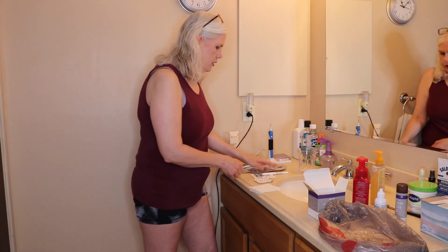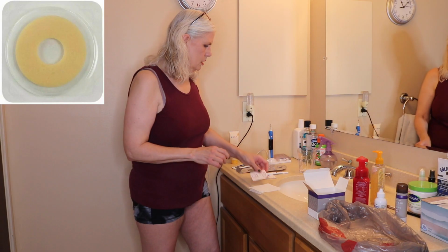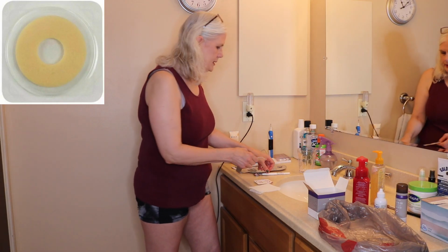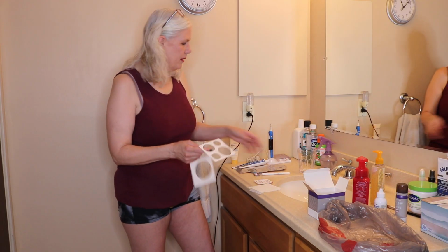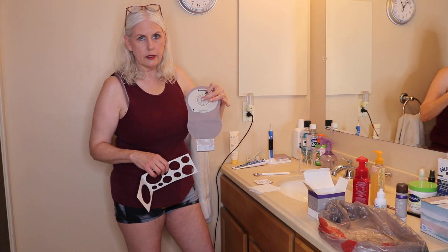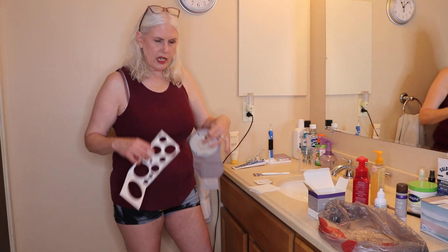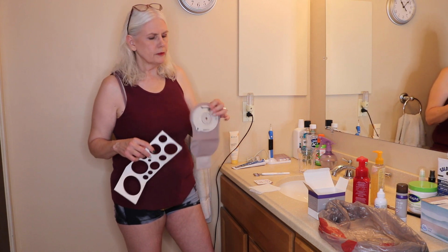So there's the bag, I have my barrier ring, and then these days I like to use my little measuring guide. The bags that I get, you have to cut your own hole. You can order bags sometimes that are already cut. But because of my having a big midline scar, I like to wear my bag off center so that it doesn't go into the midline scar, so I have less chance of it leaking.